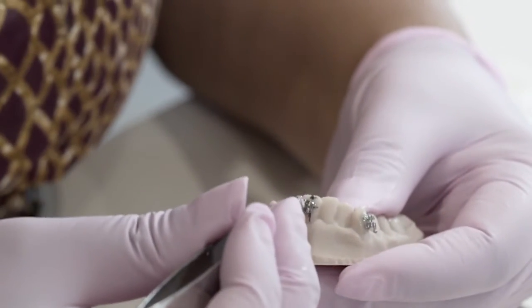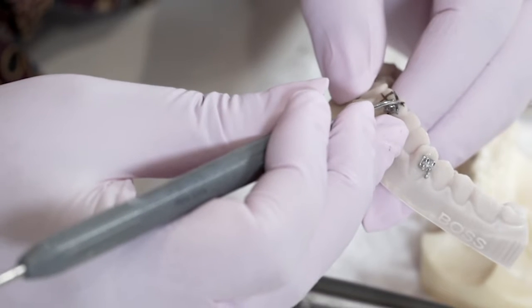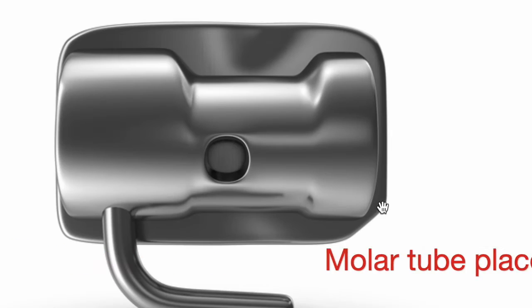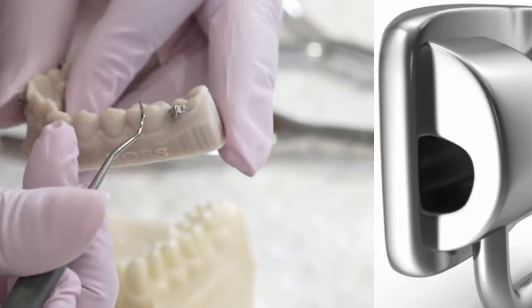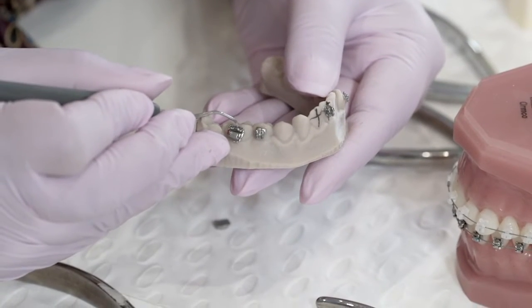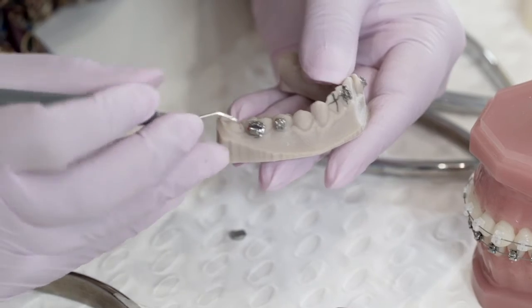I'm positioning this incisor bracket and making sure the horizontal part is lined up where I want it to be. On the sixes and sevens you use something called a tube. For the first smaller molar tube, you can line it up with the buccal groove — there's often a notch on it. Get the composite on the bracket base. There is a buccal groove on this bracket; it's really thin and you just have to feel it with a scaler. Make sure that buccal groove is lined up with the buccal groove on the six.